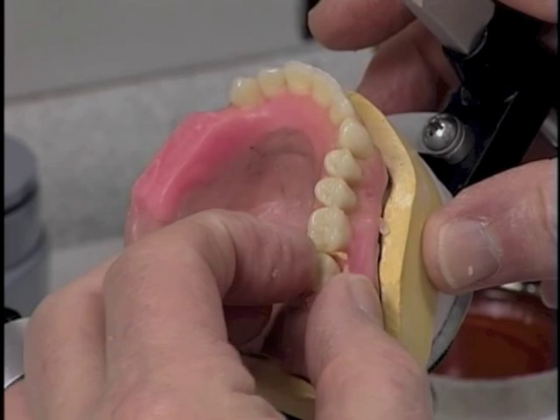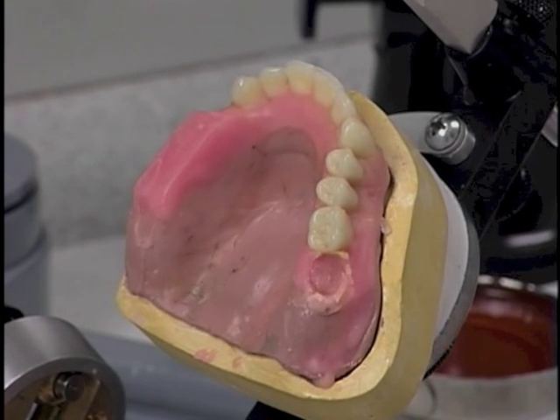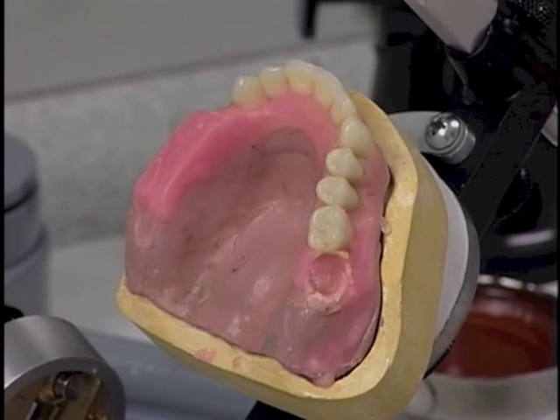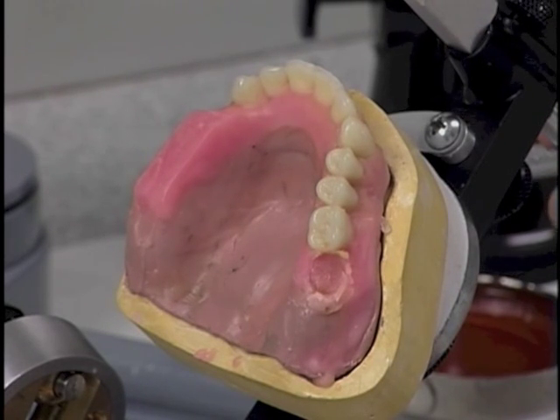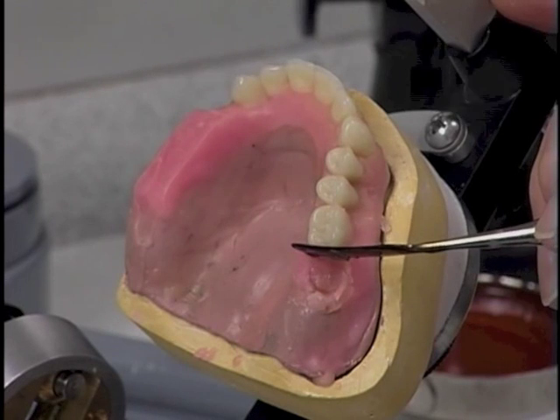And I will need to take that out and soften the wax again now, because in the process of doing that, the wax got a little bit too hard for us, so we're going to soften the wax and arrange that maxillary second molar into proper occlusion.